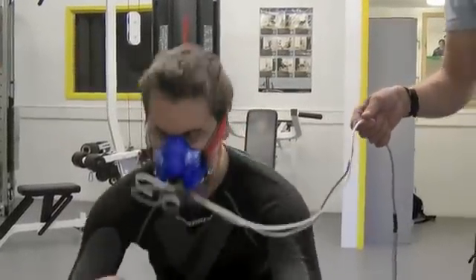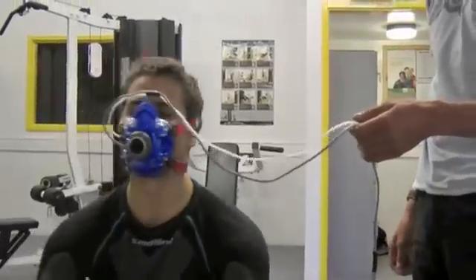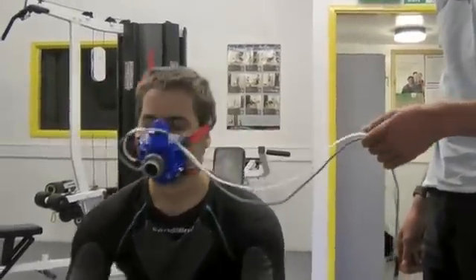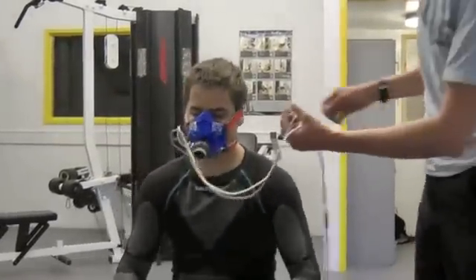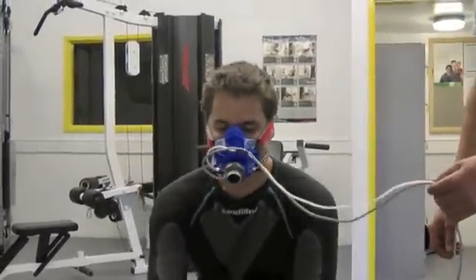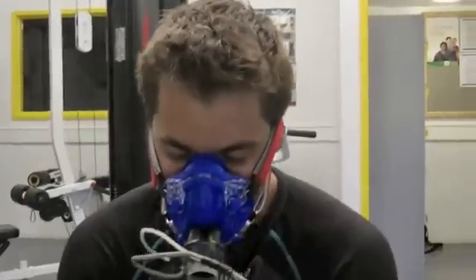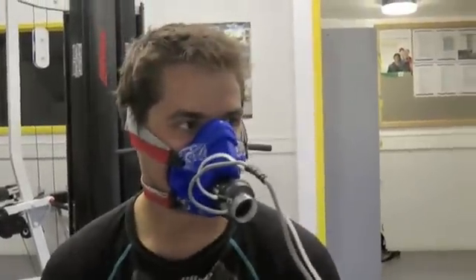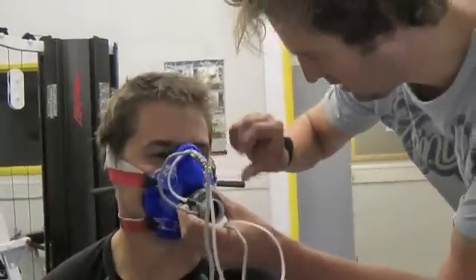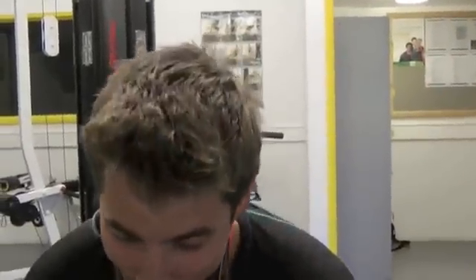Okay, keep moving backwards and forwards. Keep sliding on it. Well done Maren. Good effort. You can put the handle back if you want and just slide your legs. How are you feeling? Do you want to take the mask off? You can just take it off there. How was that Maren?